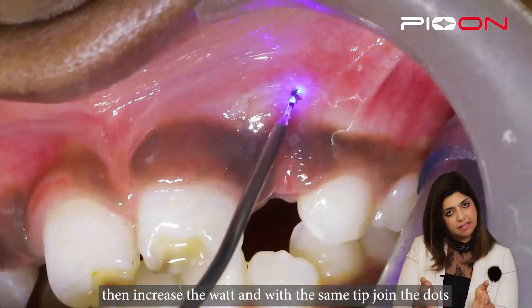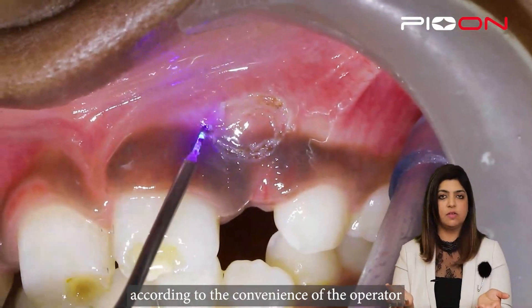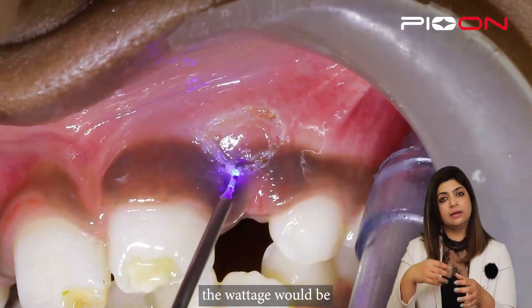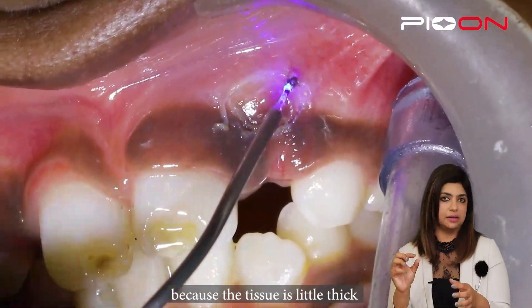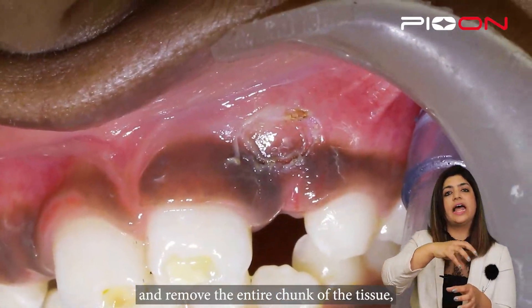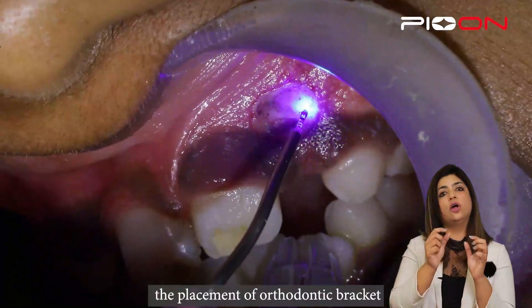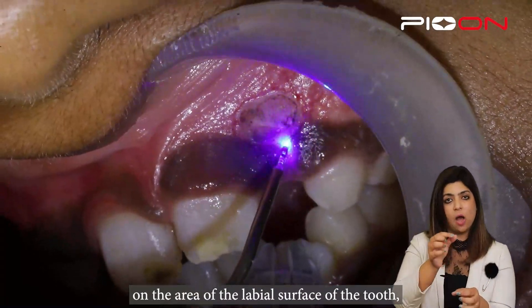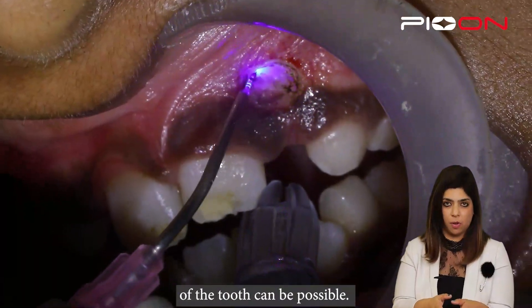Using the same tip — if you like to bend the tip, you can bend it according to the convenience of the operator — the wattage would be 0.9 watts continuous because the tissue is a little thicker. Then we will join the dots, remove the entire chunk of tissue, followed by placing the orthodontic bracket on the labial surface of the tooth so that extrusion of the tooth can be possible.